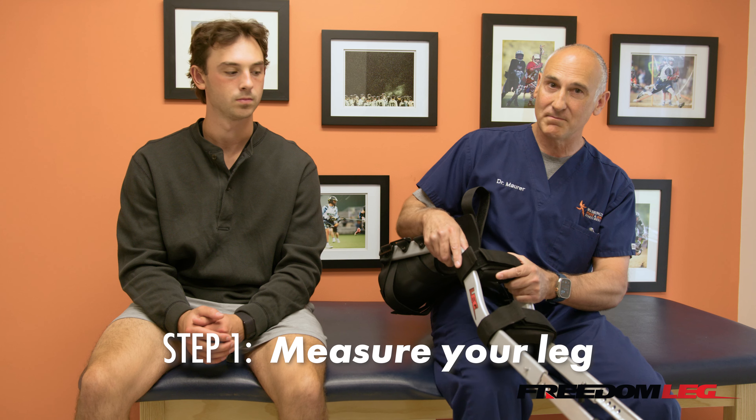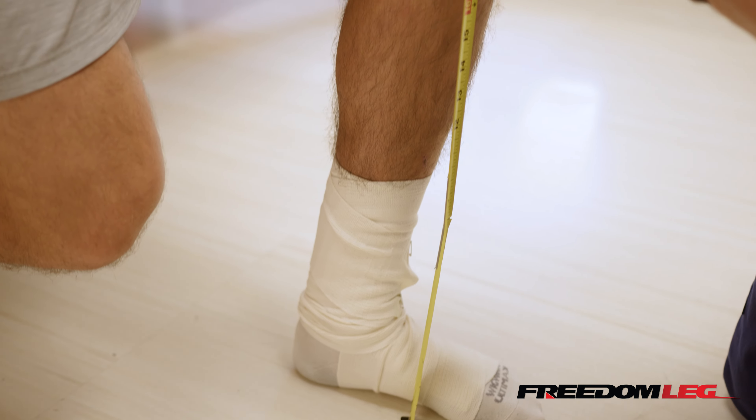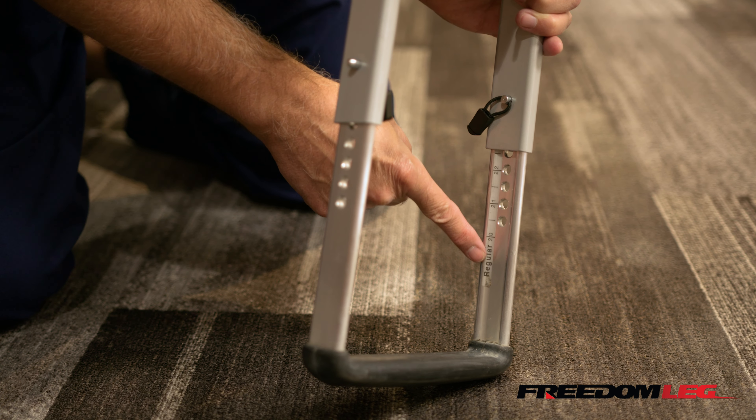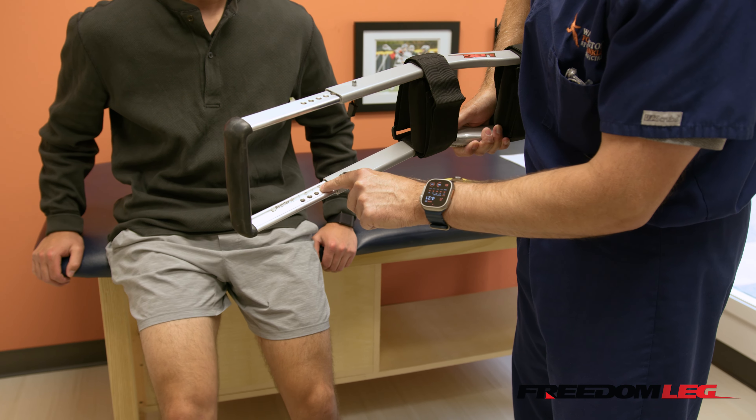First step is we're going to measure Bodhi's leg. We're going to measure from the ground to the top of his knee, and it measures 22 inches. On our freedom leg, there are little marks on the inside, and we're going to start putting it at 22 inches.